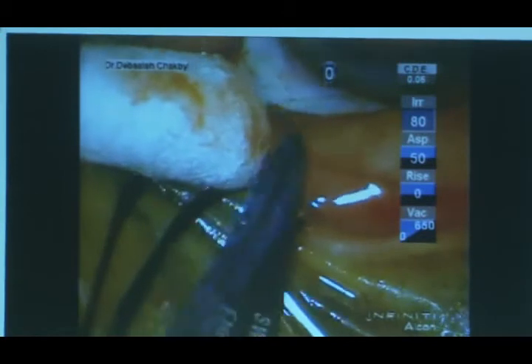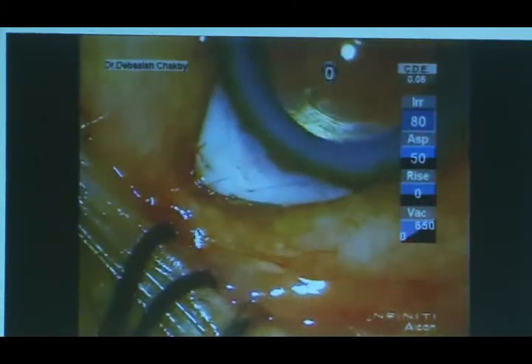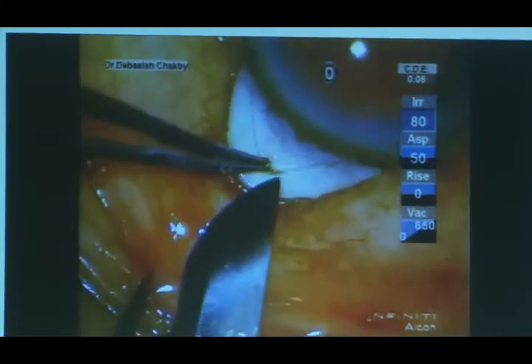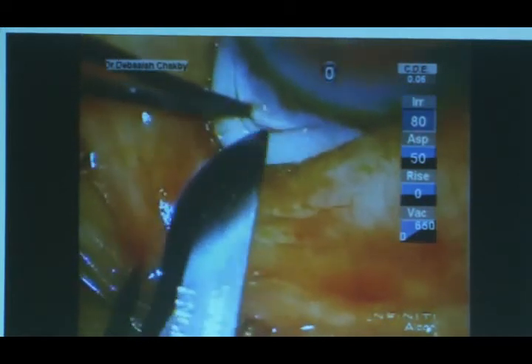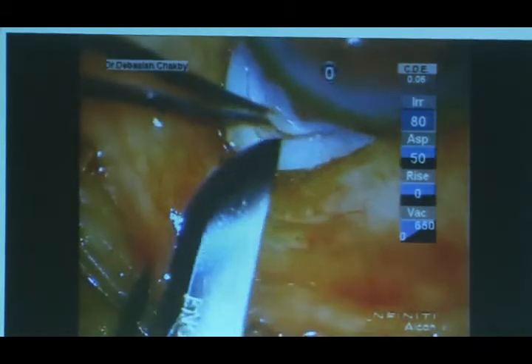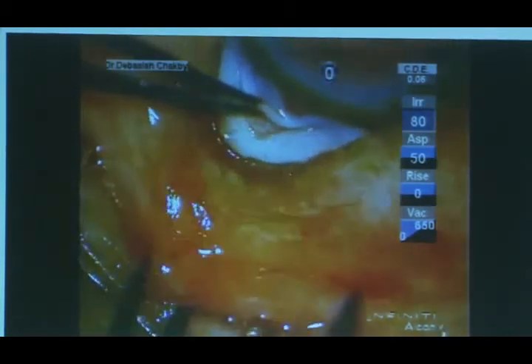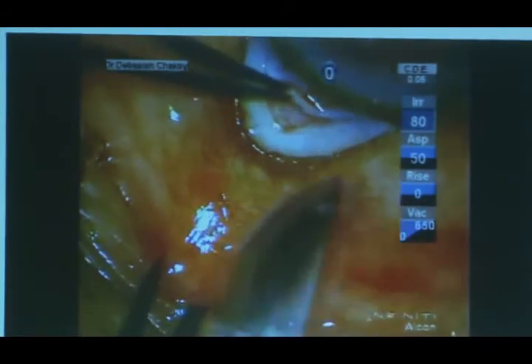So we are using number 11 blade to make the scratch incisions in the sclera. And then I am holding a limbus forceps in the left hand and number 15 blade in the right hand and dissecting the superficial scleral flap. The thickness of the flap should be around 1/2 to 2/3, because if the flap is very thin, then the closure of the sclera might be difficult and there may be too much aqueous leakage.